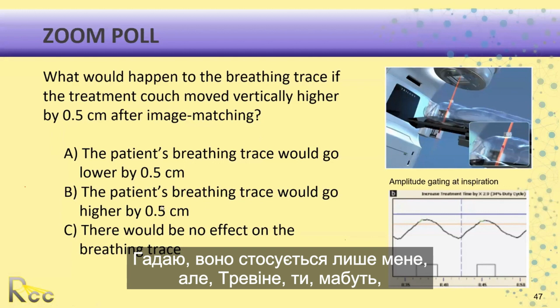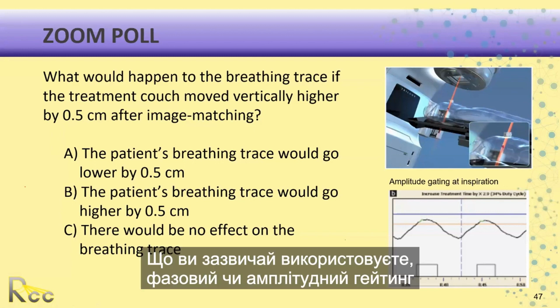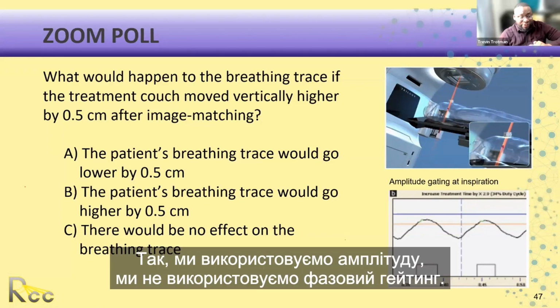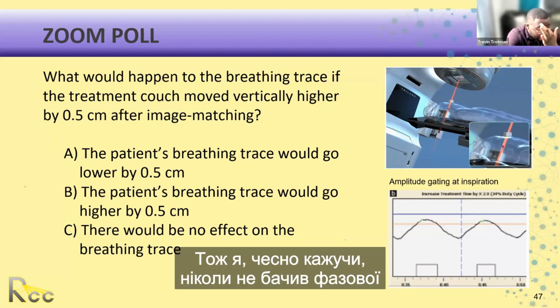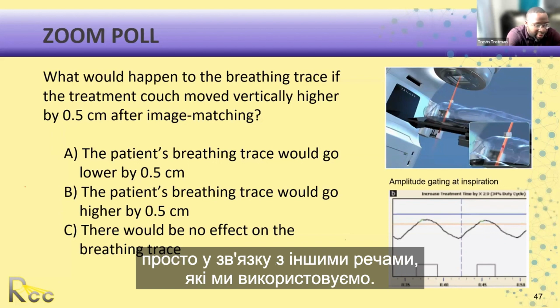There's one question. I think it's just to me, but Trevin, you could probably answer it as well. What do you usually use, phase gating or amplitude gating in your department? Yeah, we use amplitude. We don't use phase gating. Yeah, we're the same. I honestly have never seen phase gating in practice, outside of talking to our physics team about it, in correlation to other things that we use.